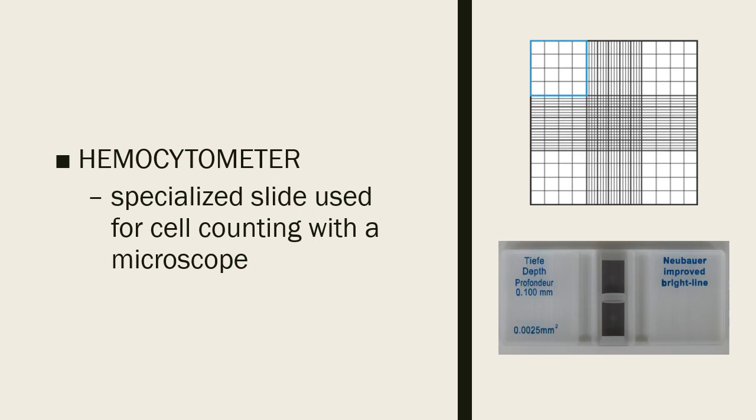Okay, and so to prepare a dilution of your sample, if you have a turbid sample or other body fluids for cell count, then you need a Thoma pipette, probably a WBC Thoma pipette, to do a dilution. With that, of course, you're going to do the dilution and then you charge. Okay, and so it is charged. The term we use in the hemocytometer is charge. It is not drop. Okay?